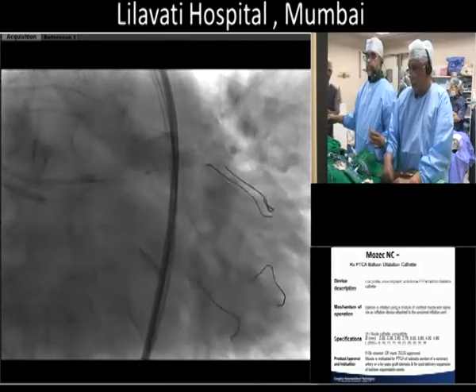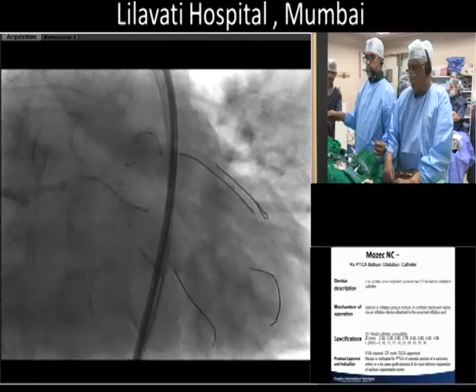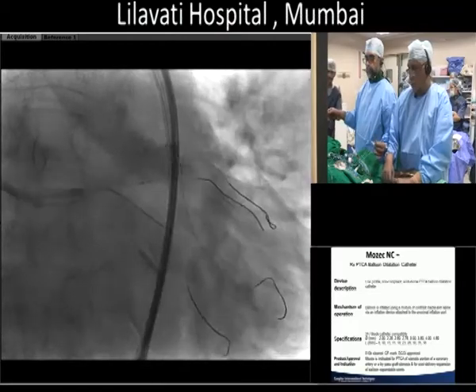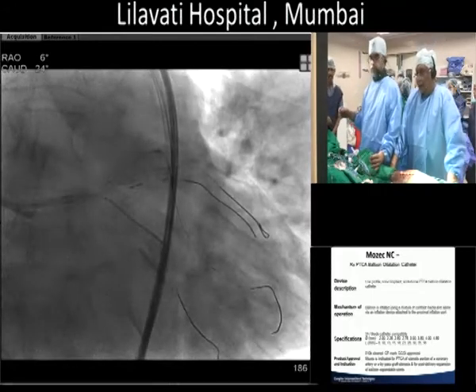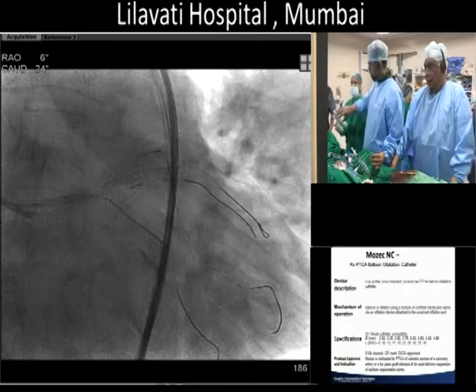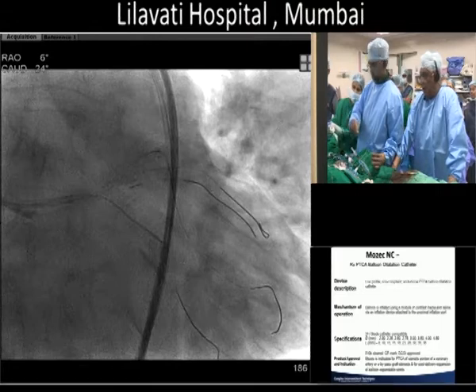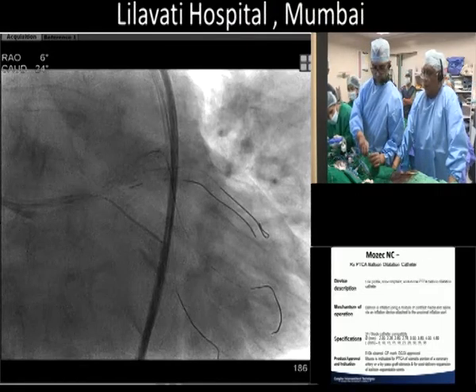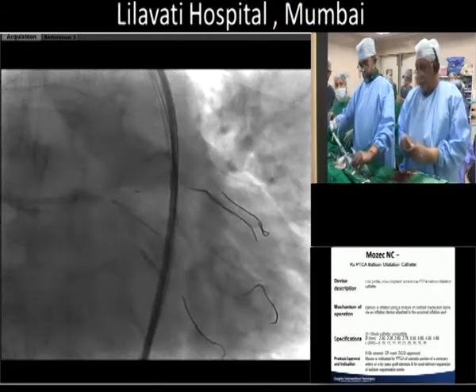And again, paying meticulous attention to ACT. For heparin, we're using ACTs every 30 minutes. Again, the Biomime, even though it's almost a 90-degree turn in a small vessel and bend distally, this tracking of the stent is quite surprisingly good. Yeah, wonderful. Yeah, absolutely.